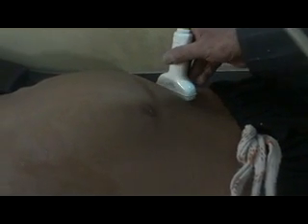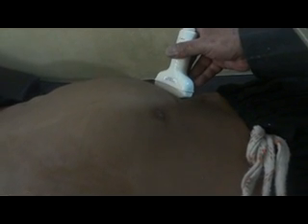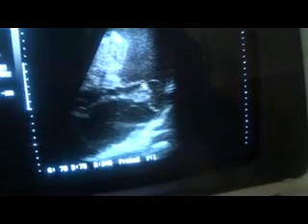Rather, it does come to the suprapubic region, but you can see it up to the left lower abdominal quadrant. Here, see that with well demarcated outer margin. This line shows low level fine echoes and septa.